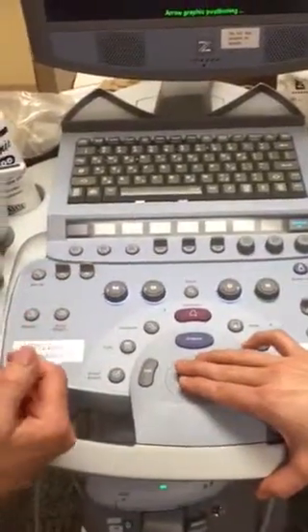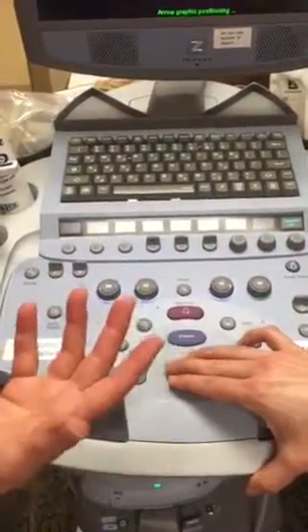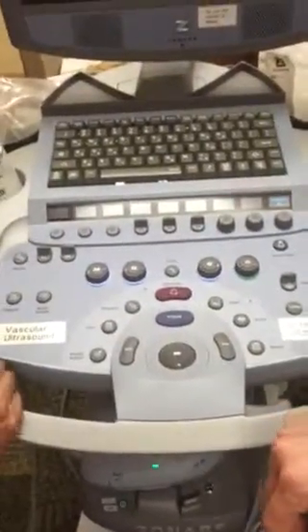You don't even have to hit set again. You can just stop, and it's fine. How does it stay there though? It just stays there until you move it. Well, hit set for 1 second. That's what happens. Now we're done with this. We want to save that image now.